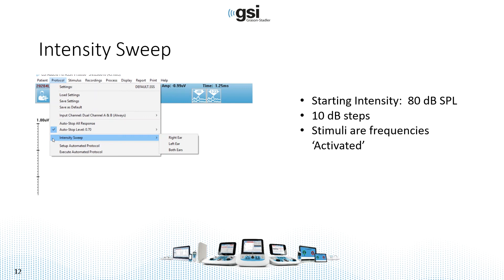The stimuli that are tested are any of the frequencies that you've activated. So this is hard coded into the software, but it's there should you want to use it.